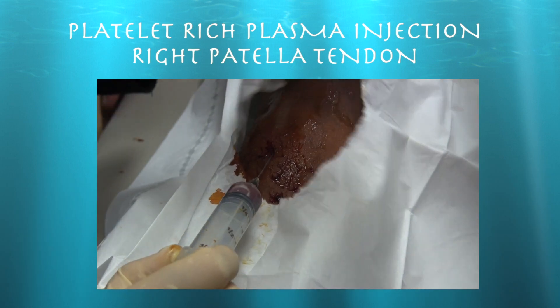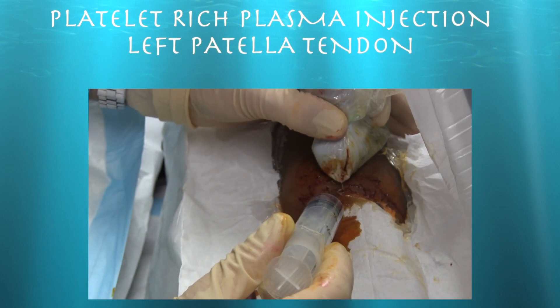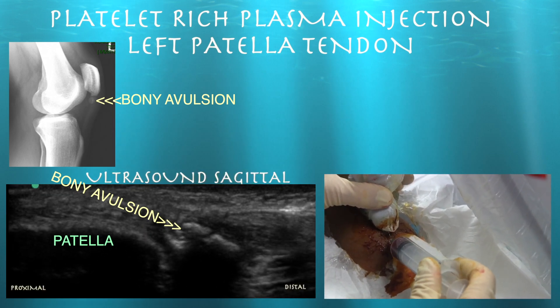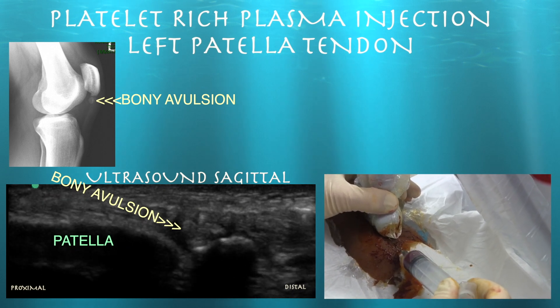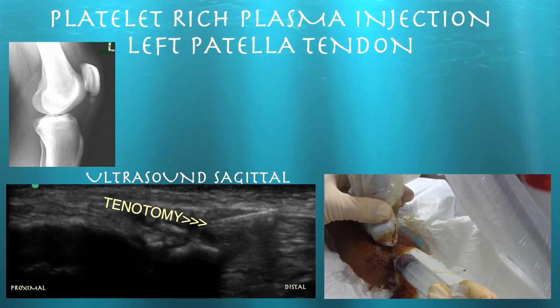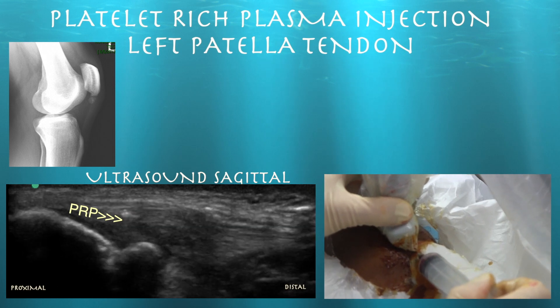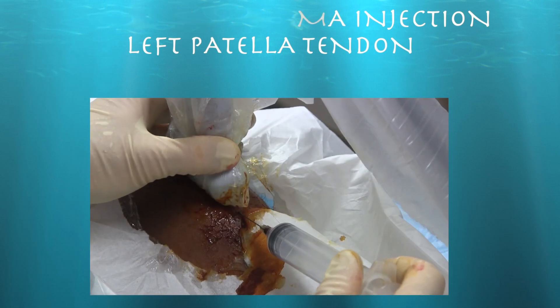He opted to do both knees in one day. Now we're doing his other side. This side isn't as bad and he has a little avulsion from his inferior patella. The right knee lit up more on color Doppler compared to the left in the region of the proximal patella tendon, consistent with his symptoms. On the left side we're doing a tenotomy, going right into those calcifications and avulsions of the inferior patella. Here's the PRP — you can see a little blush of PRP going into the proximal patella tendon. We dedicated most of the PRP for the right knee, which was more symptomatic.